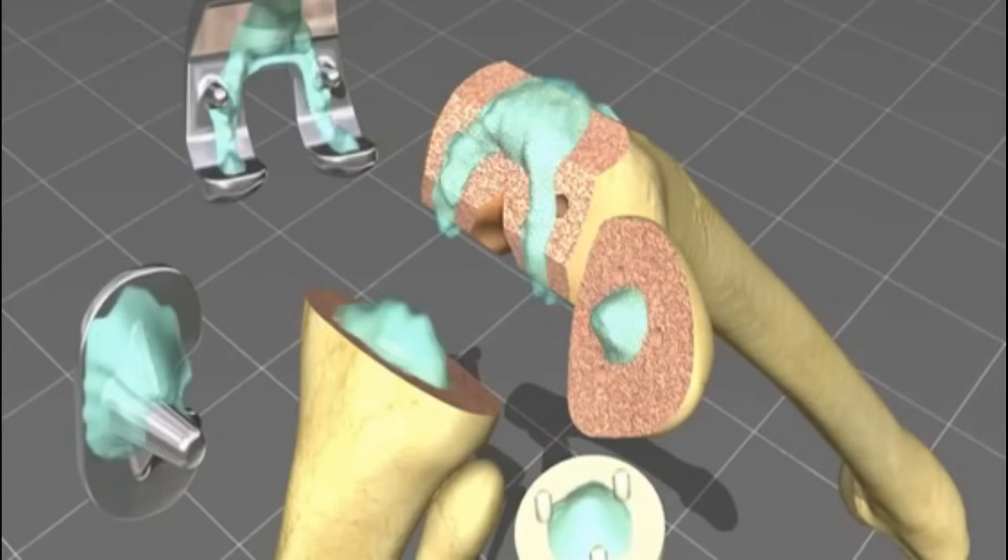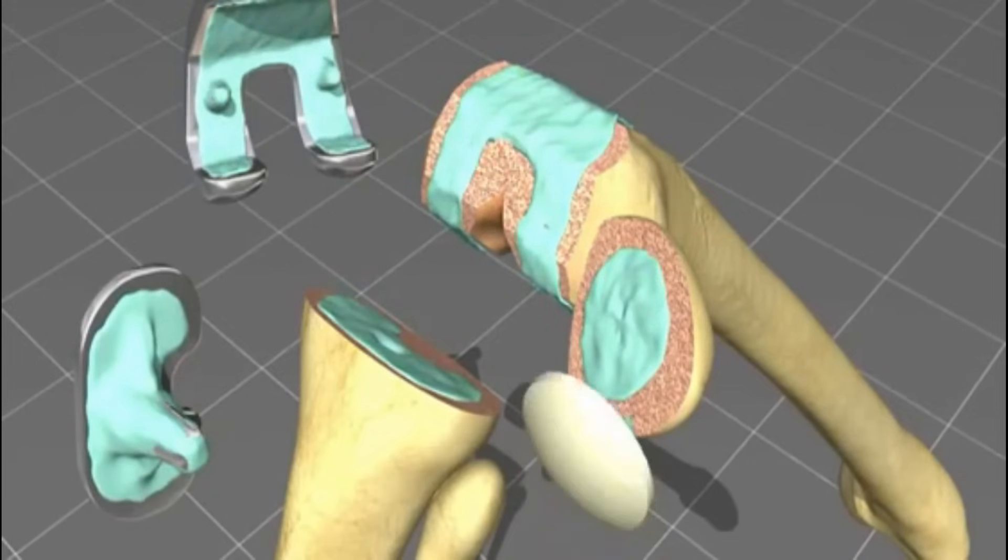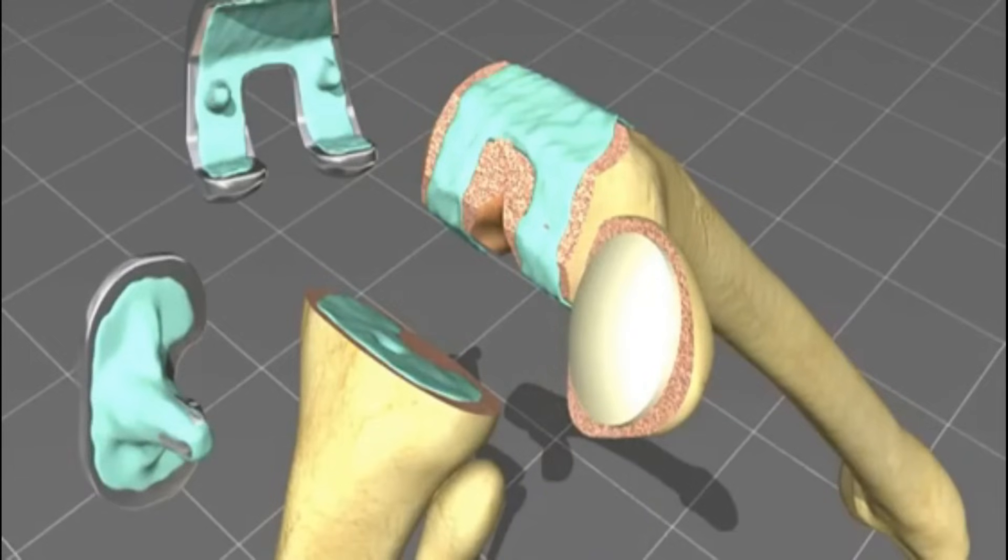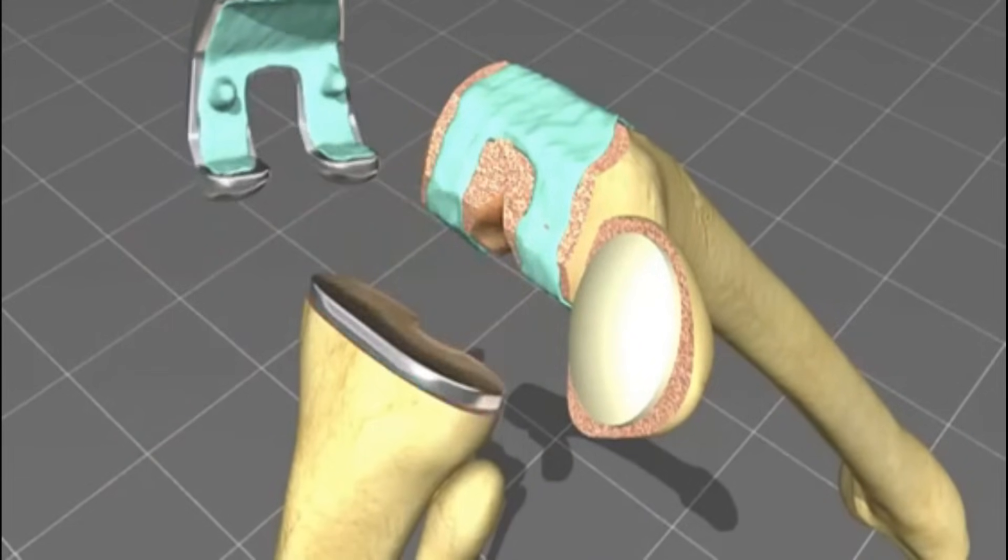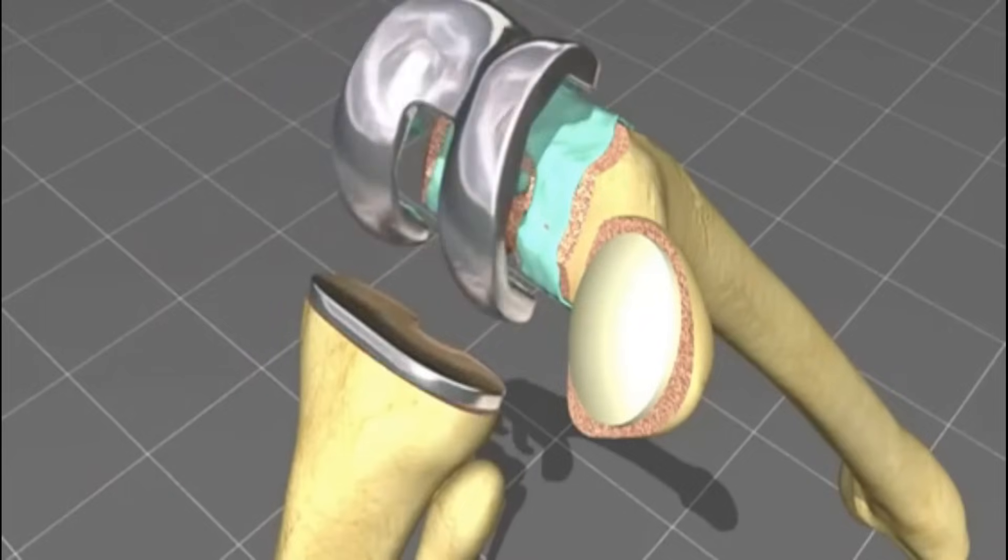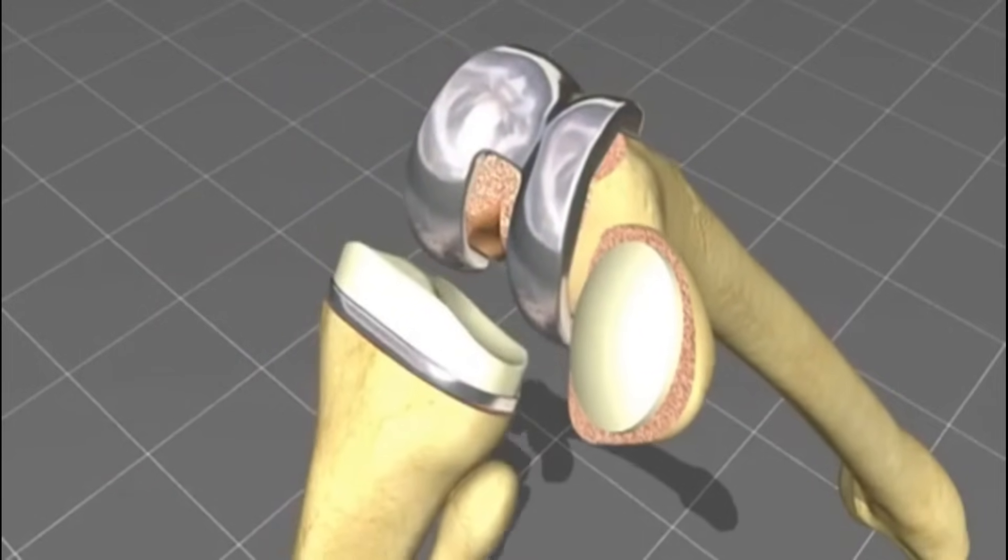After removal of the trial components, the original prosthetic components are glued with bone cement. The advantage of bone cement in total knee replacement is that the components are immediately stable and the bone surfaces are sealed by the bone cement.